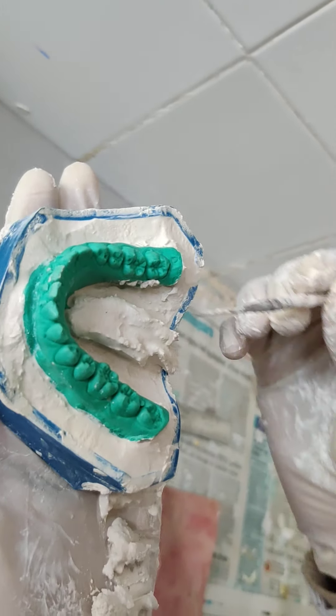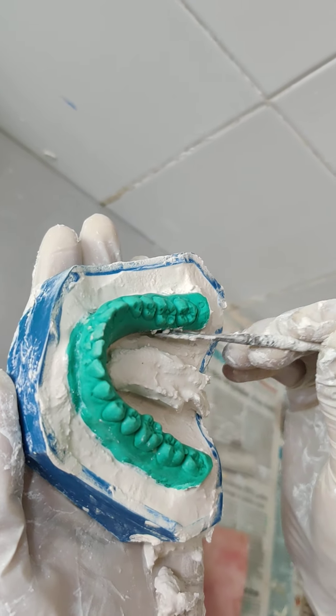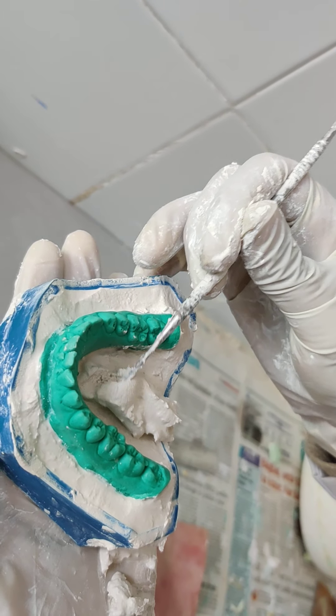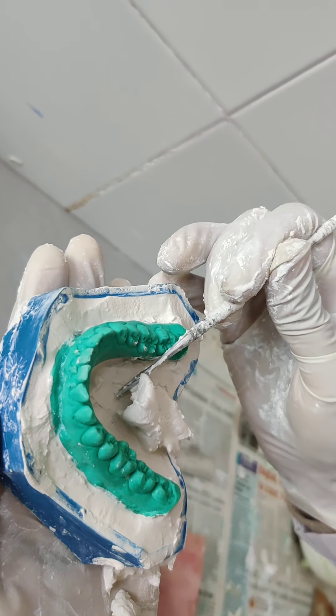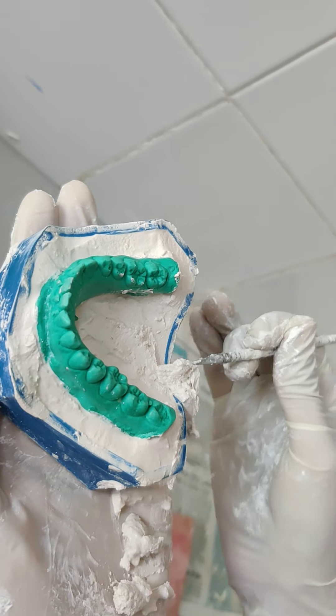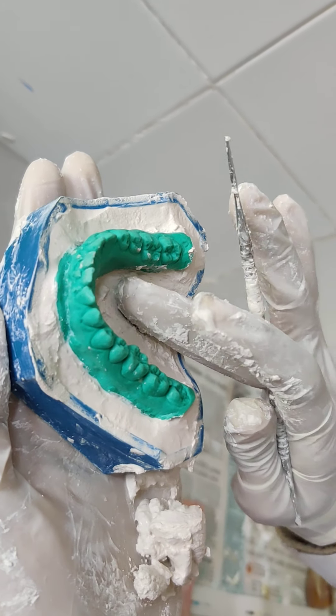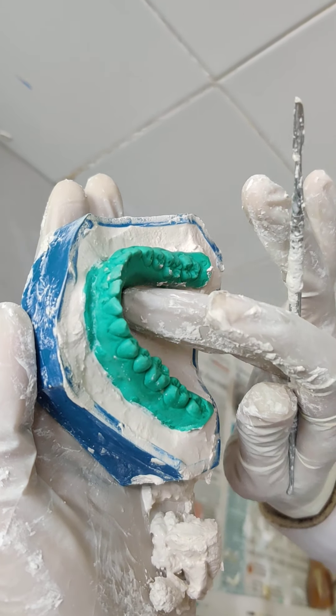Now clean your mandibular cast and remove all the excess plaster from the vestibular area, the lingual surface, as well as the buccal surface, making sure that there is an even amount of plaster in all areas both buccally and lingually.